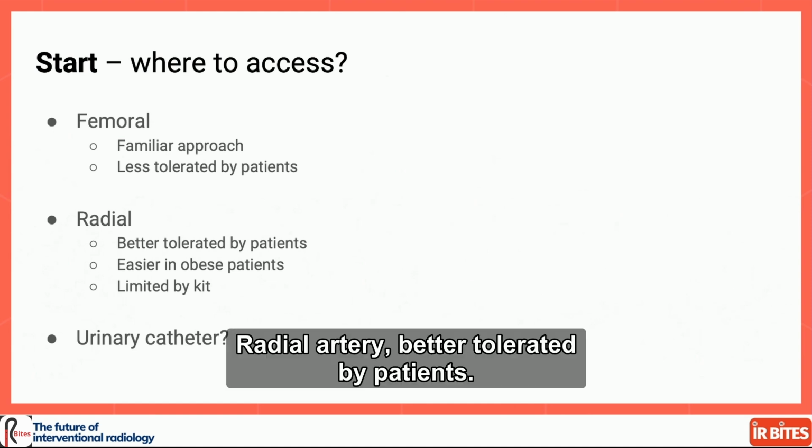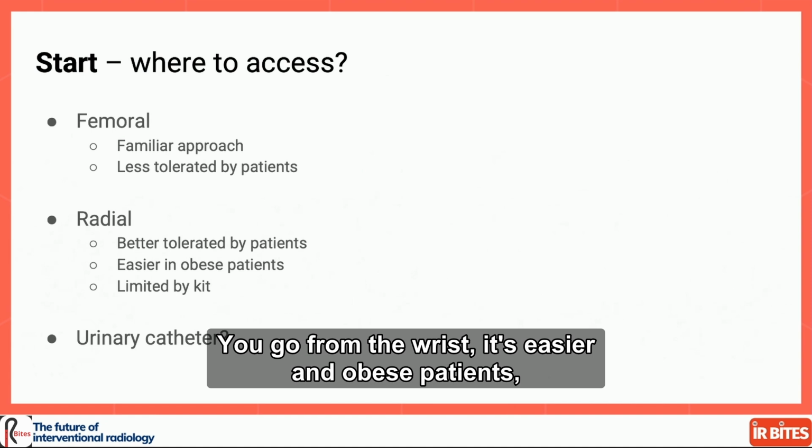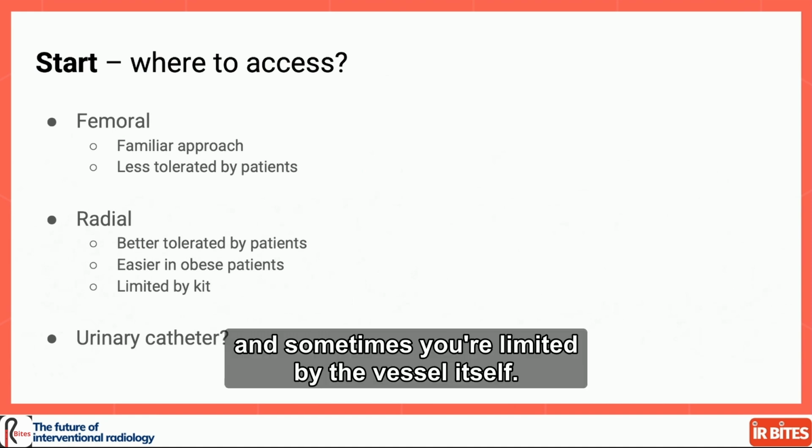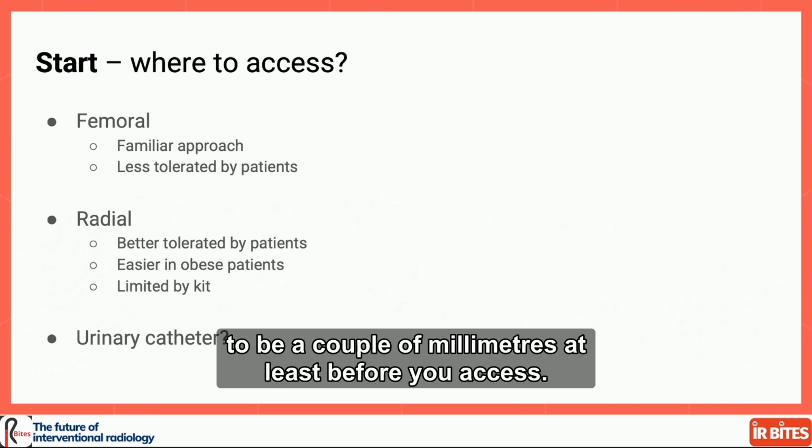Radial artery, better tolerated by patients. You go from the wrist, it's easier in obese patients, but you're limited by kit. And sometimes you're limited by the vessel itself. You want to have the vessel be a couple of millimeters at least before you access.